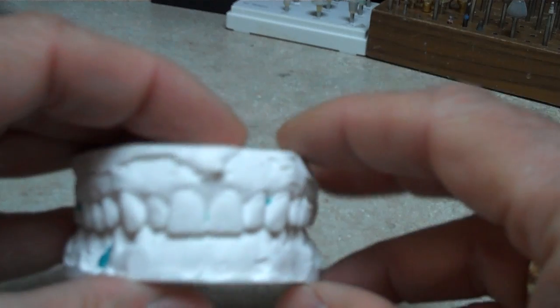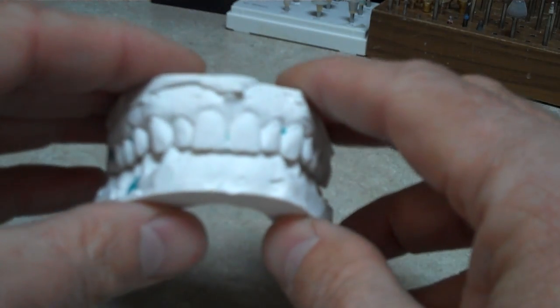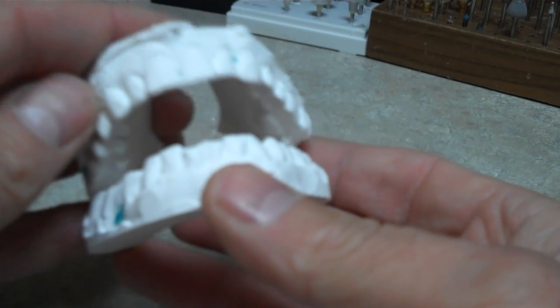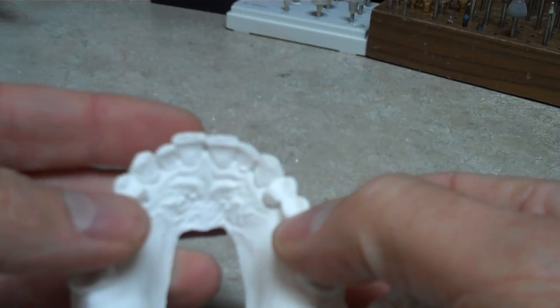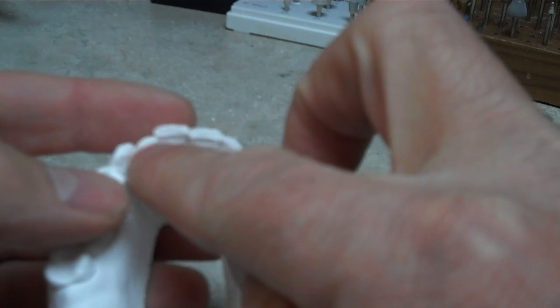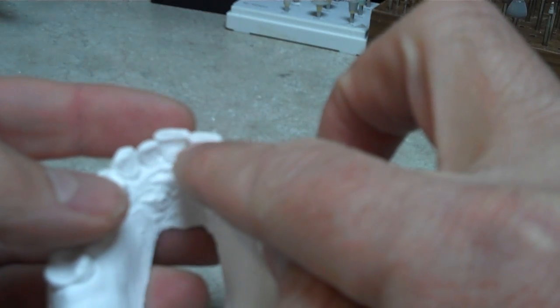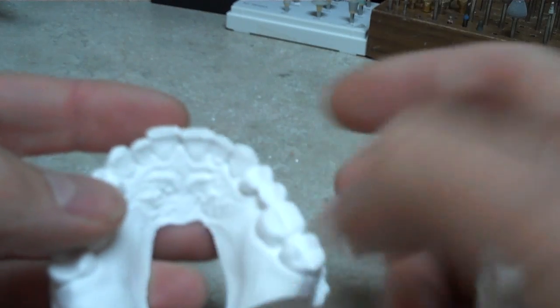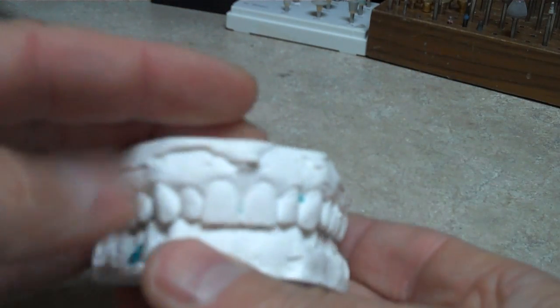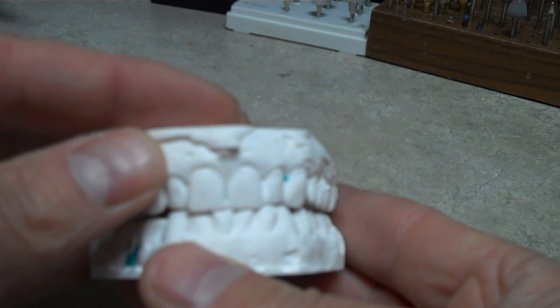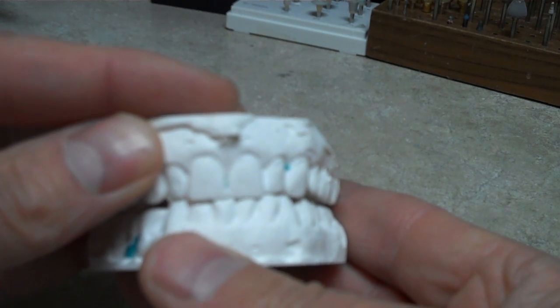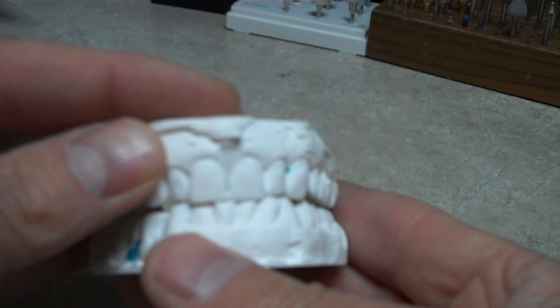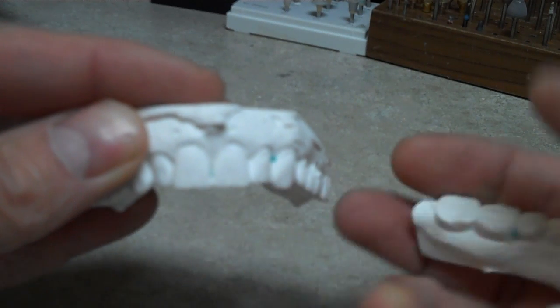What I want to do first, before I fabricate an appliance, is evaluate what I need to fabricate. I look here and I can see some lingual wear on the maxillaries, but it's restricted to the lingual side of the incisal table. If I look at how those match up, I can guess with confidence that this patient is not going much past an edge-to-edge position.